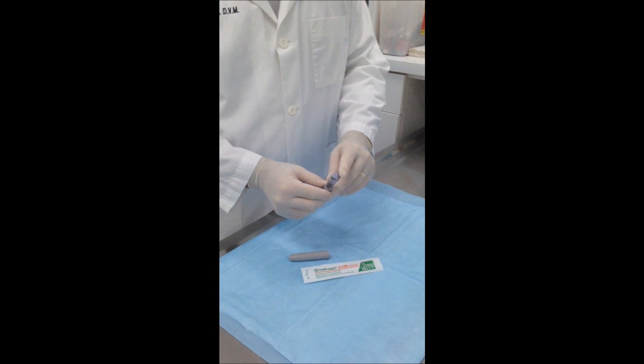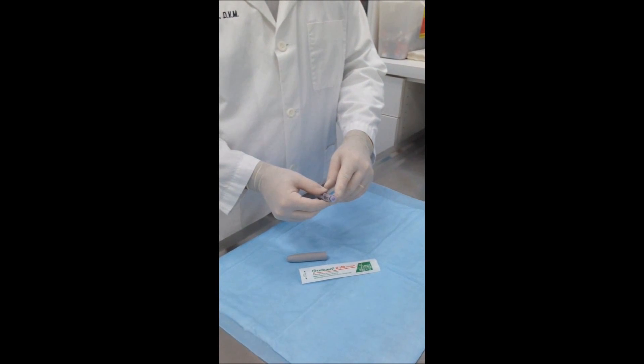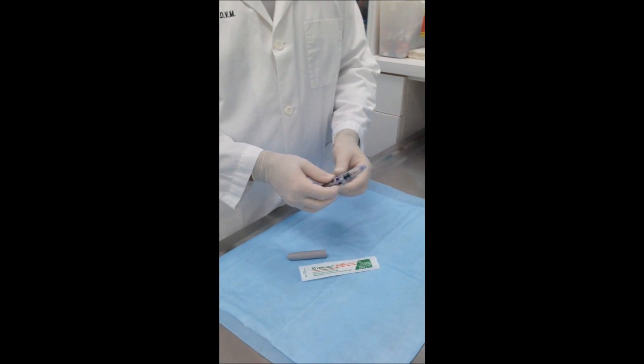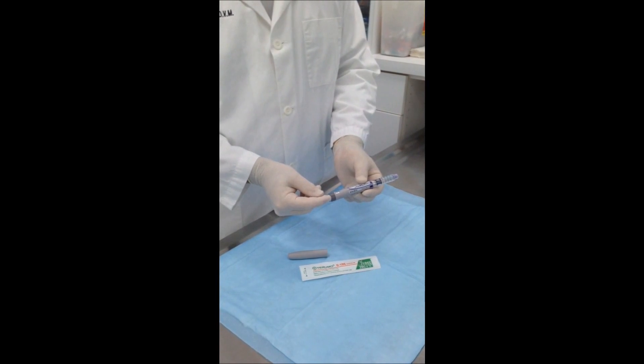There is essentially a rubber stopper at the end of the Lantus pen that's intended for attaching disposable needles which then the people would use to administer the insulin to themselves.